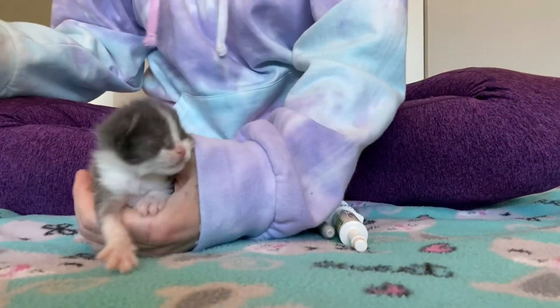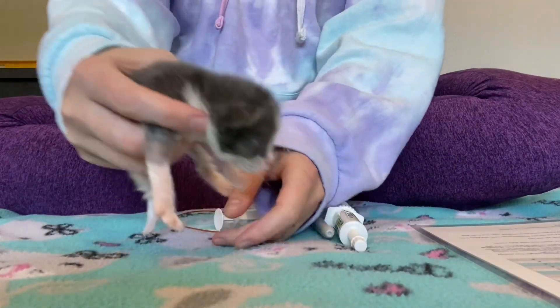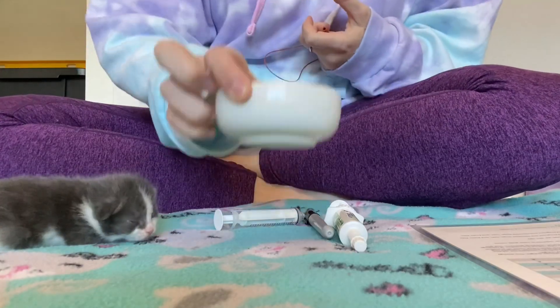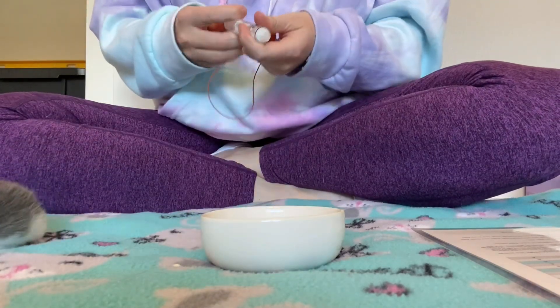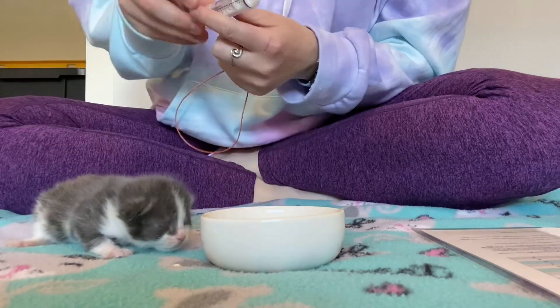Always play it safe and never give a kitten more than their stomach can handle. This is very important because otherwise you could cause the kitten to vomit. The tubes used on kittens range in size from 3.5, 5, and 8 FR. I have a 3.5 FR tube on hand, so that is what I use today. Normally, a 5 FR would be better for a kitten of this size.